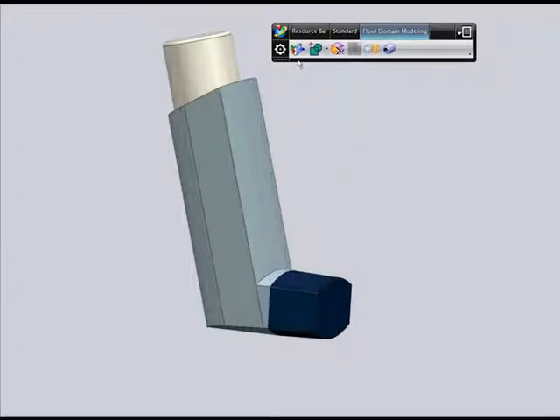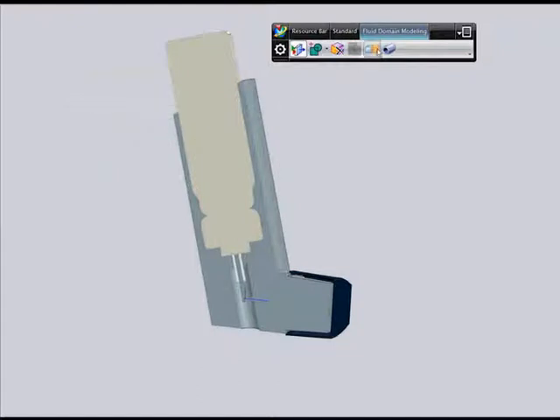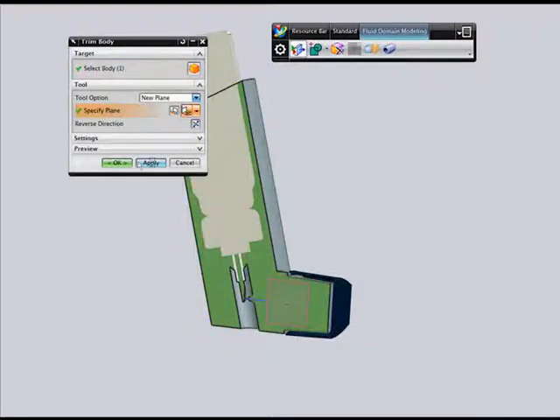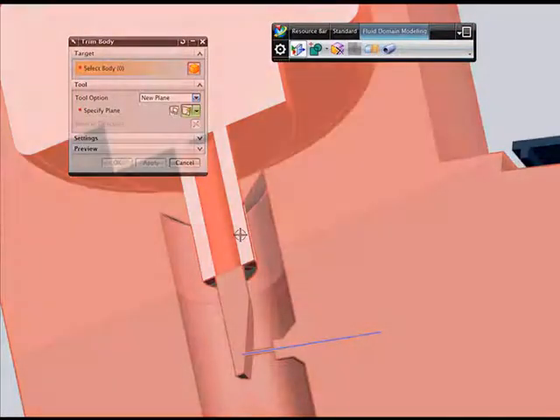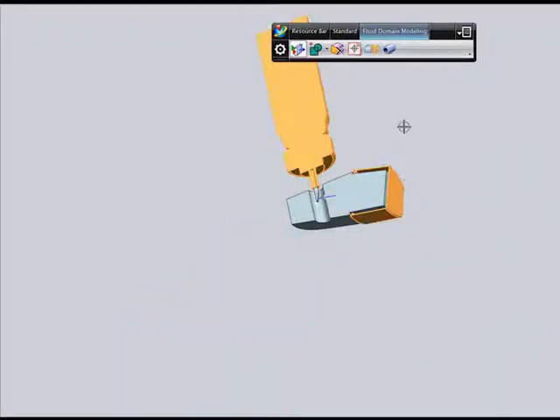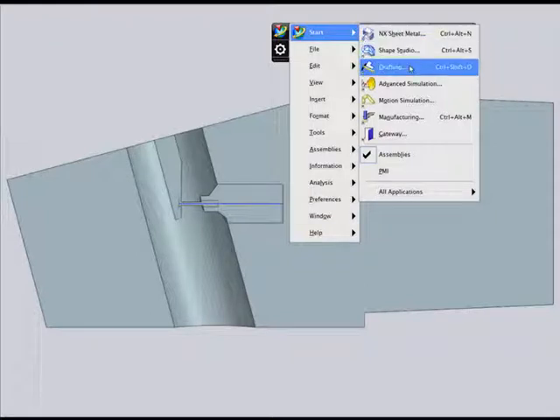The first step of the process is to create the geometry representing the air volume inside the inhaler. The volume will span between the injector, which is the part attached to the pressurized medication cartridge, all the way to the breathing port. Using traditional CAE tools, creating this air volume would be tedious and time-consuming. However, NX greatly simplifies this task with analyst-oriented tools for geometry idealization, along with the full suite of NX modeling tools, including synchronous technology. The next step is to mesh the air volume.